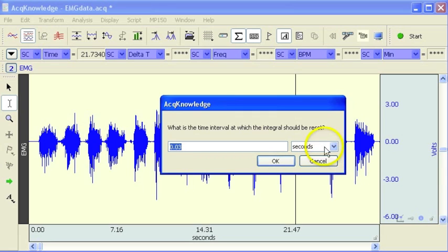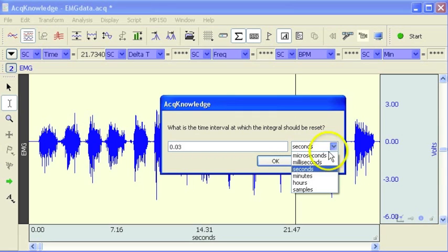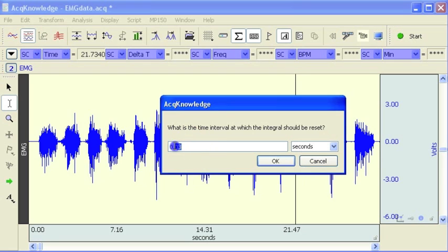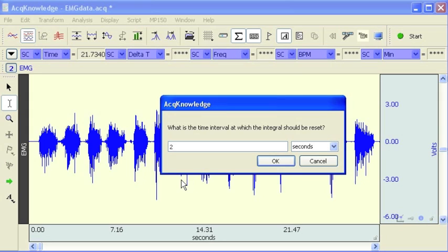I'm going to put in a 2 second time window. So the integral is basically going to count and continue counting until it gets to the 2 second point and then it will reset itself back down to 0. And it will continue counting again up to the next 2 seconds and then it will reset itself.